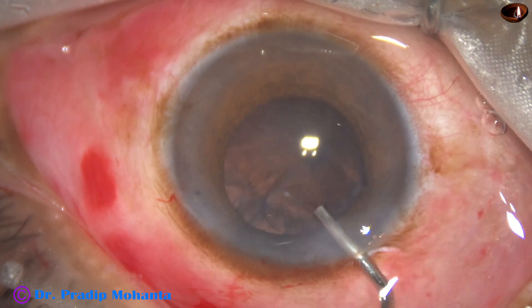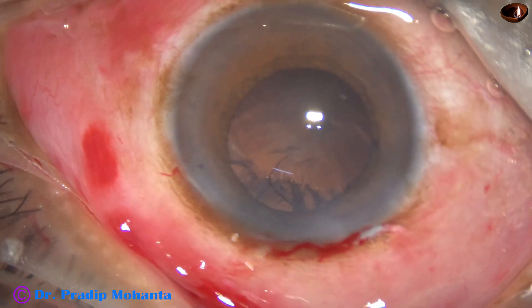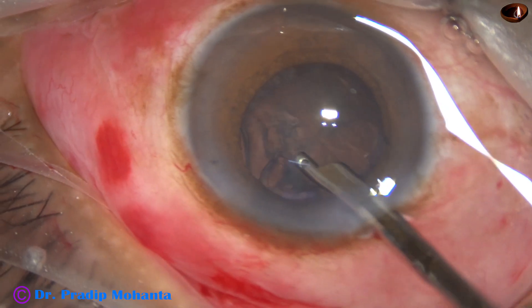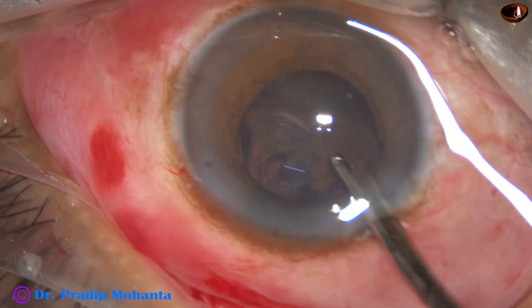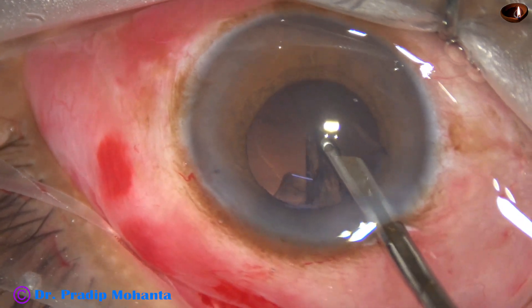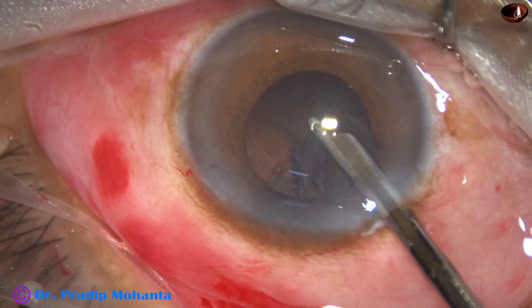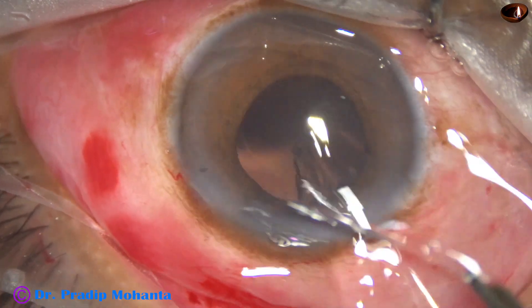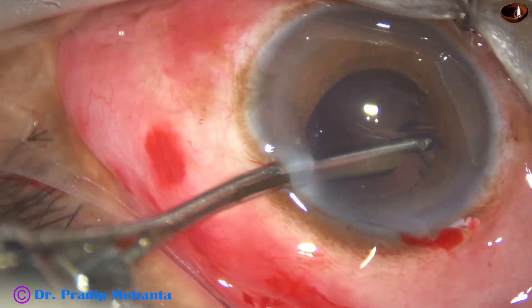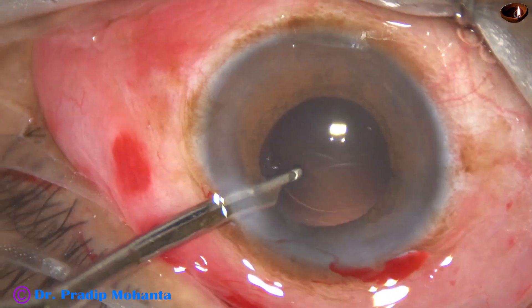Now is the most crucial part: removal of the cortex, which is firmly attached to the capsule. Whenever the zonule is weak, we have to watch carefully what we are pulling — whether we are pulling only the cortex or whether the capsular bag is coming along with it. I find the rhexis margin, confirming this is cortex that has come out. Going through the side port, I remove the cortex from nine o'clock to twelve o'clock. Cortical clean-up has been very satisfactory.